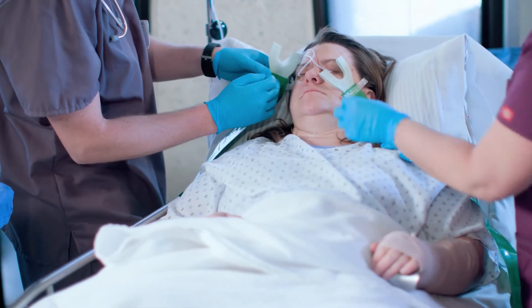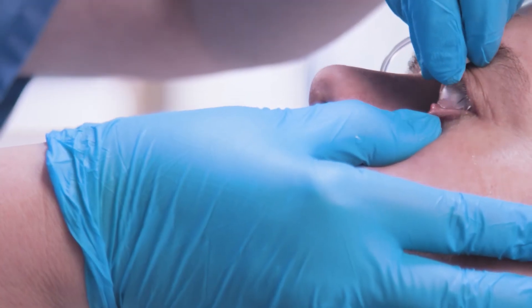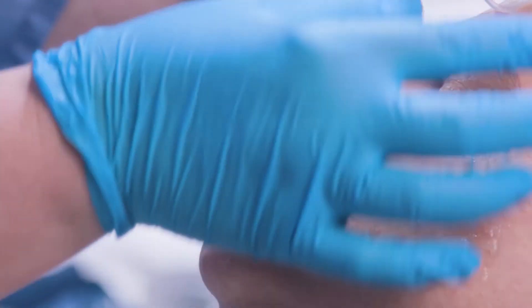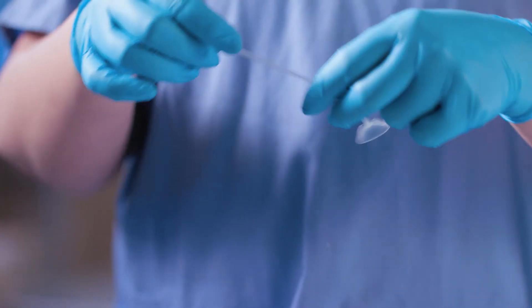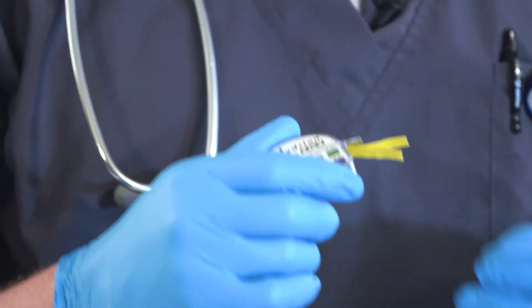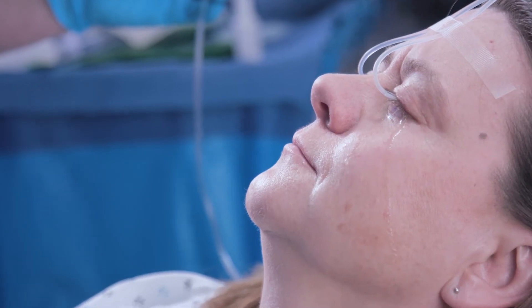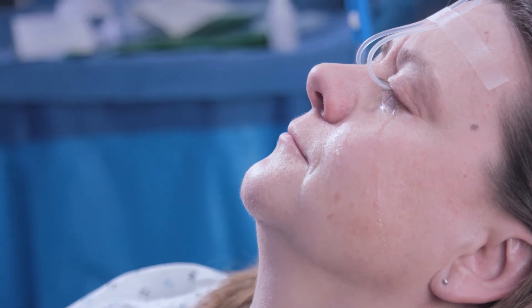Removal is just as easy. With the solution still flowing, instruct the patient to look up, retract the lower lid, and slide the lens out. Once the lens has been removed, stop the flow of solution and place the lens in a clean location. Recheck the pH after 10 minutes to ensure it's remained neutral, and repeat the irrigation process if necessary. When finished, dispose of the lens properly.